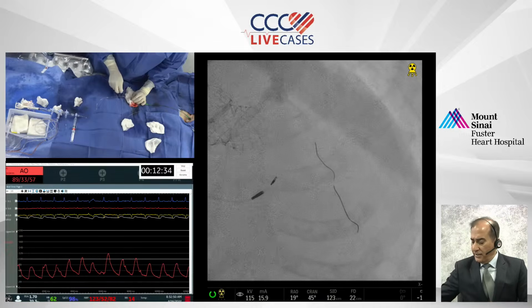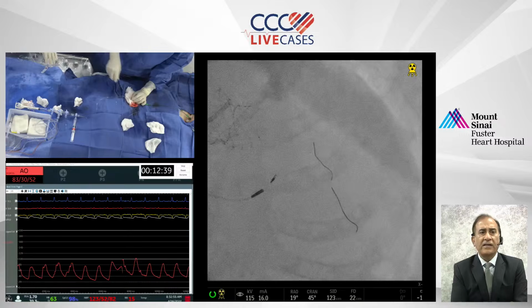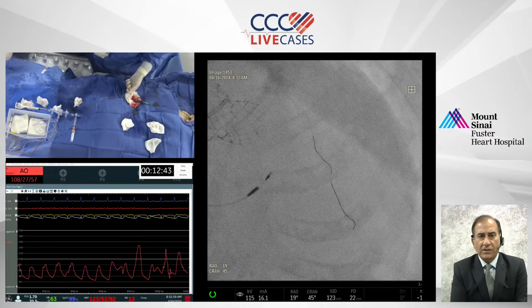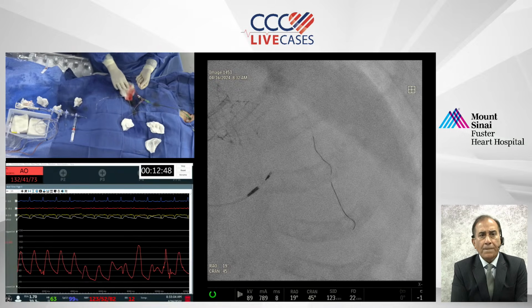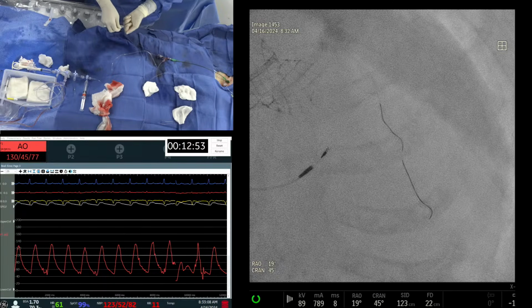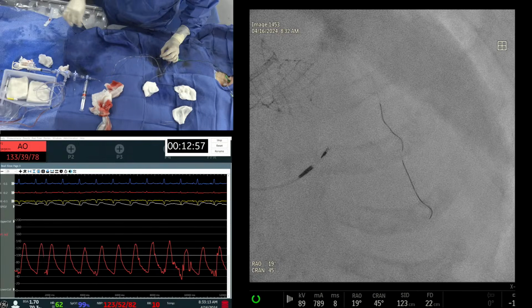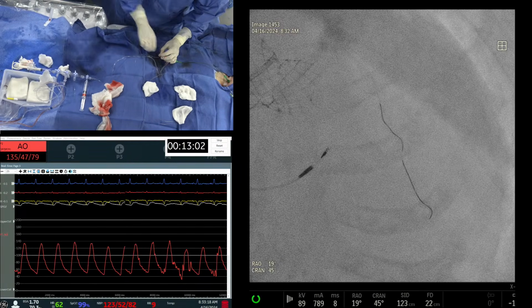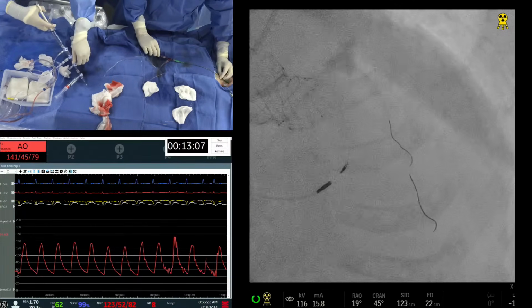So you were mentioning towards the beginning of the case about possible IVL here. Absolutely. Yes. You're happy with the result with the rotational ablation? Well, rota sure, but we knew that IVL would not have gone. So after the rota, the question was to do balloon dilatation, and if you cannot open it, there's no need for extra burr. But then in that particular case you combine with the IVL. So that was the key.